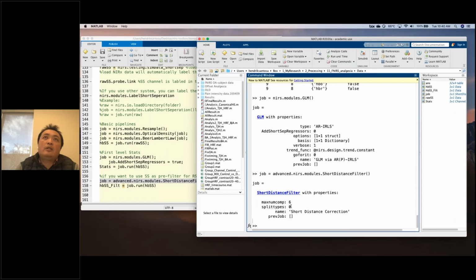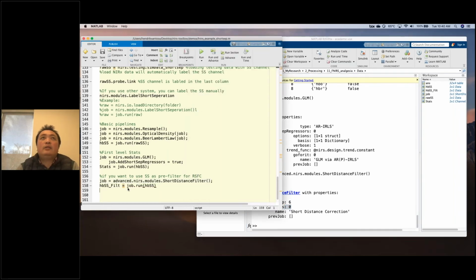You can select split type as false. It means no split. We use the oxyhemoglobin. That is the best one from the paper. But if you want to use only oxy and also only the deoxy, you can change this one to true. And then after that, you can run on the oxyhemoglobin.